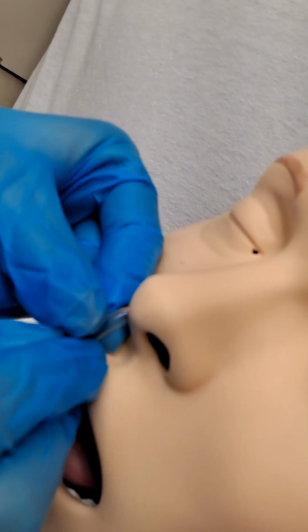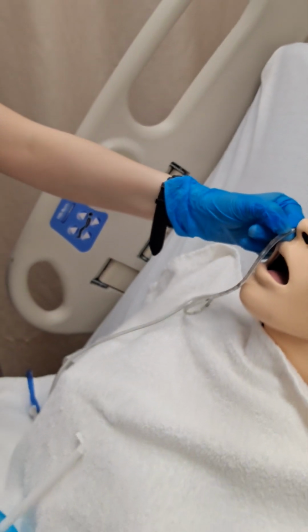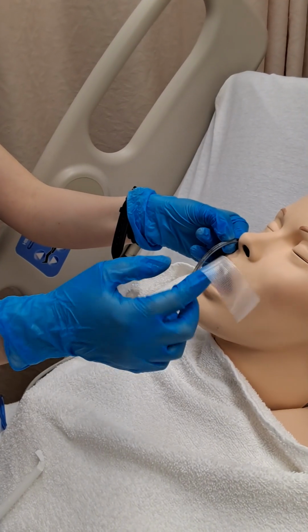So now I'm going to secure it with tape. This is when I would use my skin barrier and swab.